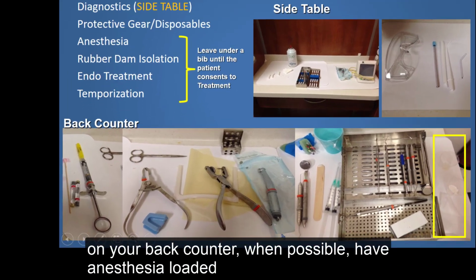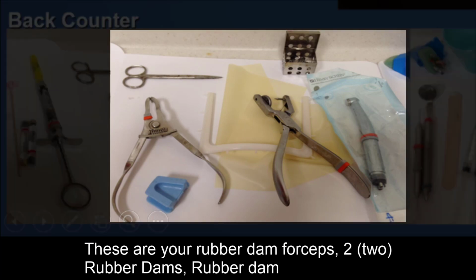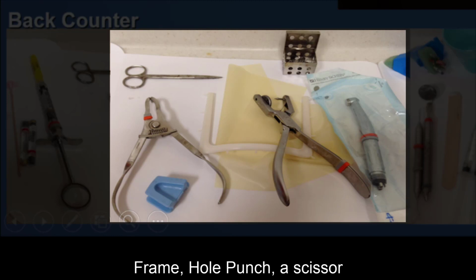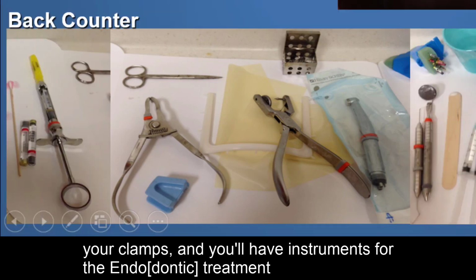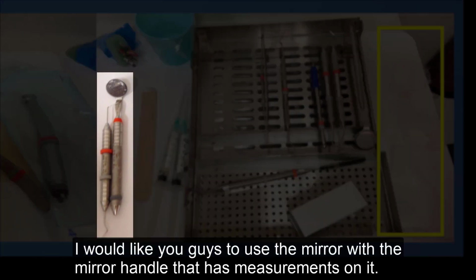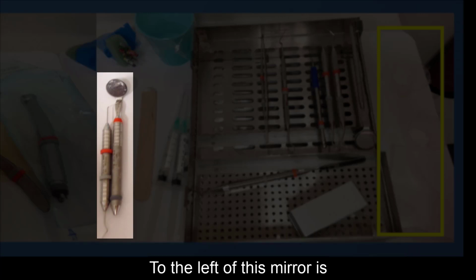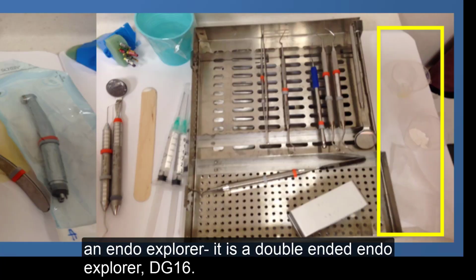On your back counter, when possible, have anesthesia loaded. Also on the back counter is your rubber dam isolation. These are your rubber dam forceps, 2 rubber dams, rubber dam frame, hole punch, a scissor, your clamps. Then you'll have instruments for the endo treatment. Here you'll have a mirror. I would like you guys to use the mirror with the mirror handle that has measurements on it. To the left of this mirror is an Endo Explorer. It's a double-ended Endo Explorer DG16.